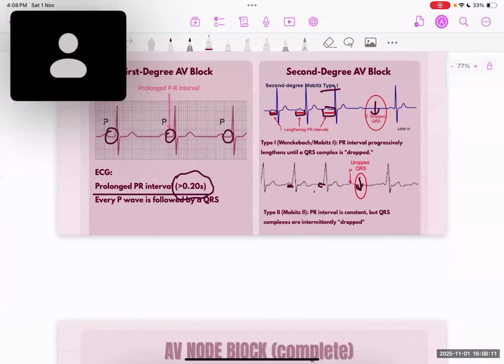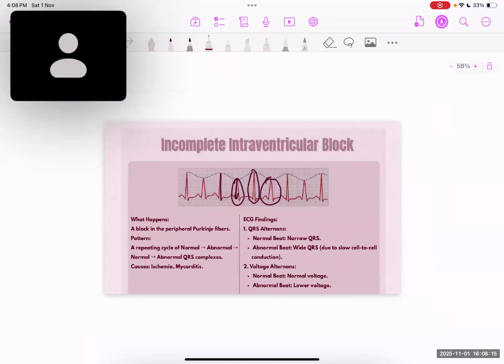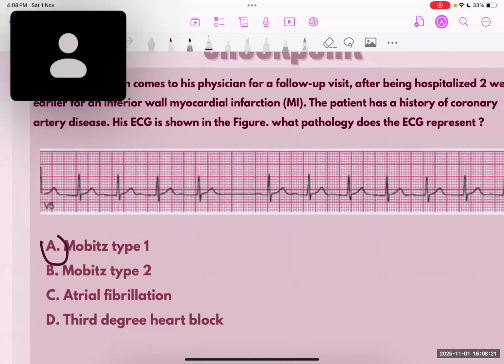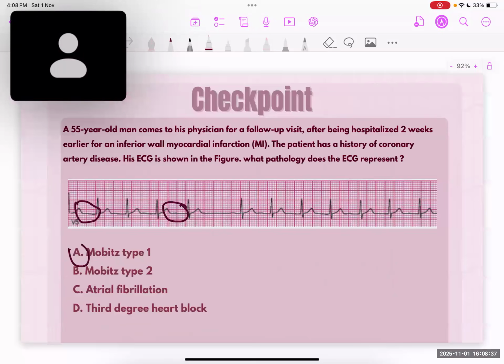Is that clear now? In the exam, in the image, when I saw it on my iPad, you can't even tell where the T wave is here, but maybe compare from here and then compare it here. Do you see the difference now? That it's a bit longer. Okay, it's very faint, that's why.